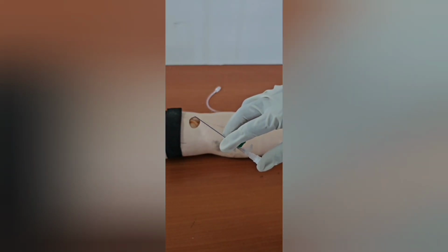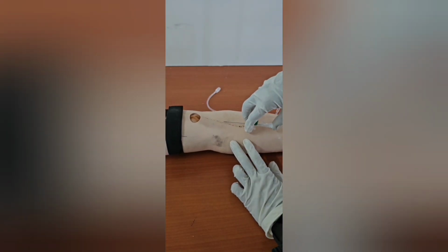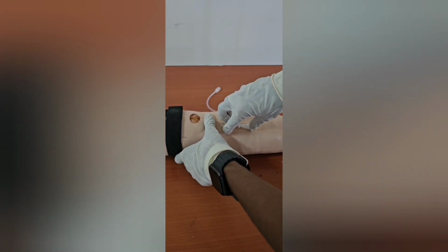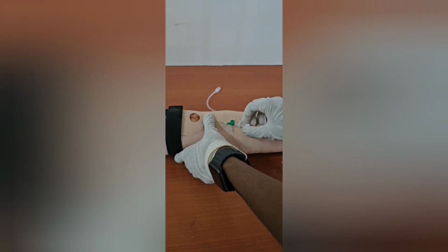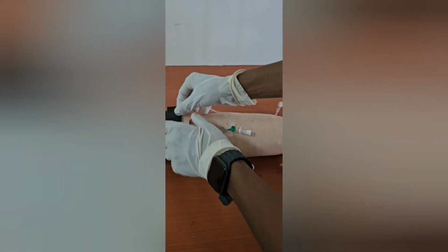Then insert the needle at an angle of 25 degrees. Puncture the skin and move the needle into the vein. Make sure to hold the syringe and needle steady. Aspirate briefly. Then remove the tourniquet.